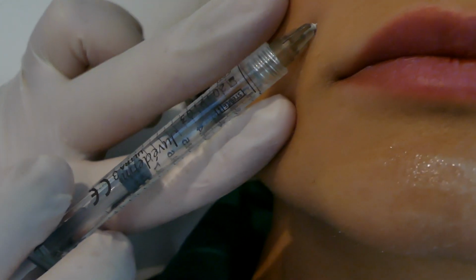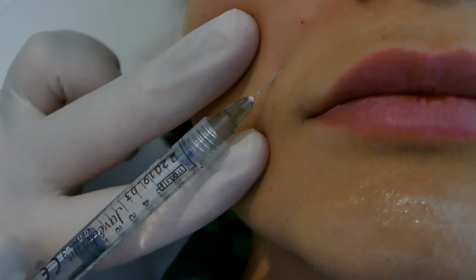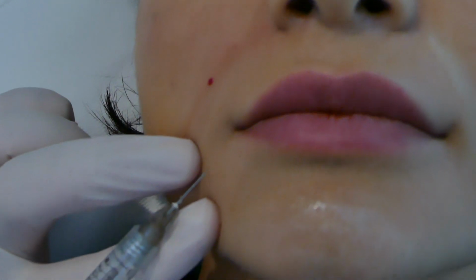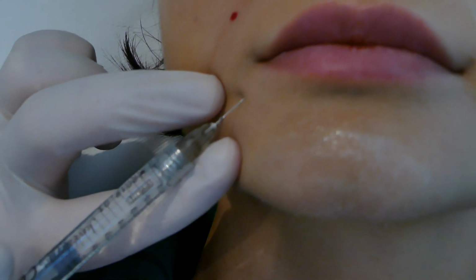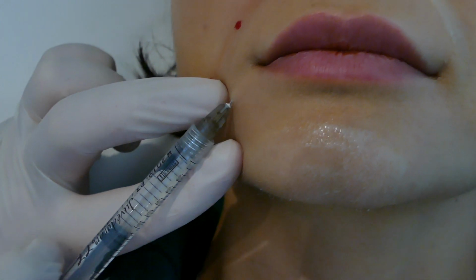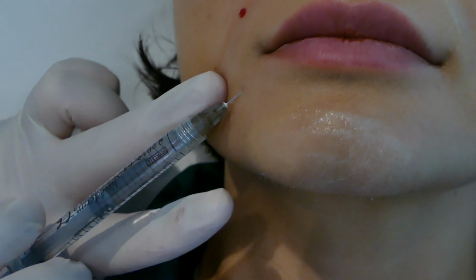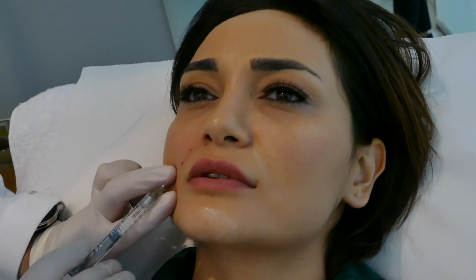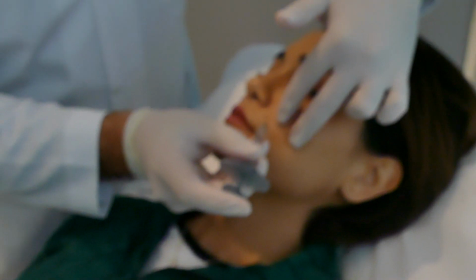The middle third of the nasolabial region is injected very superficially in a linear fashion just underneath the crease, and then a gentle massage to distribute the filler. Similarly, the lower third of the nasolabial crease is also a superficial injection. This is injecting the labiomental fold, again a fanning technique in the subcutaneous region.